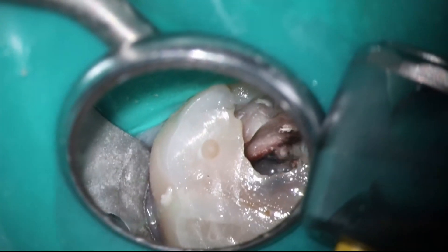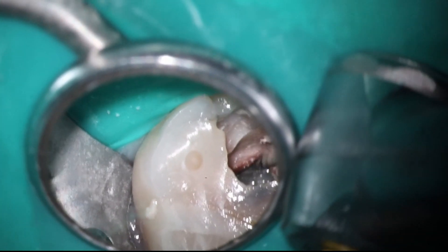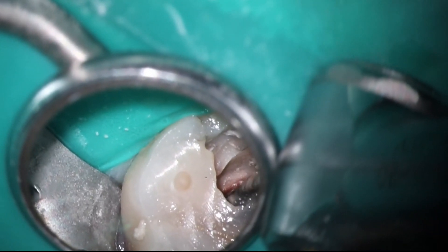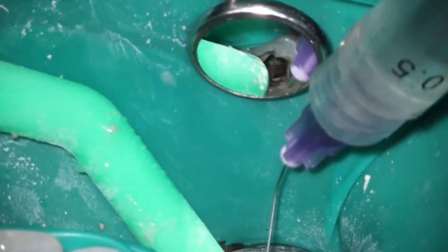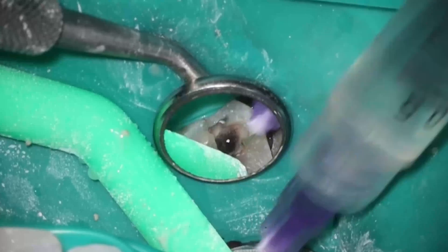Sometimes the rotary is able to grab these canals better. As far as the MB2, I'm not using a ton of pressure. It's really light pressure — you want to have the file itself do the work and find it for you. We're talking maybe half a pound of pressure, very light, almost letting the weight of the handpiece itself do the work. We're going to use Triton; it seems to work really well in these cases to get all that nastiness out.